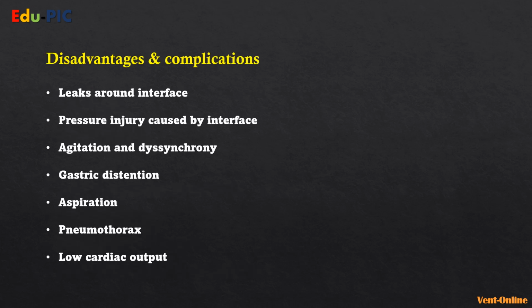And that goes forward to talking about disadvantages and complications when we're talking about non-invasive ventilation. So the first disadvantage is sometimes it's not reliable as a delivery method because you can have lots of leaks around the interface itself, around the face, which means you're not achieving the pressures you're targeting. You can also cause pressure injuries by the interface if you try to diminish the leak and keep things really secure on the face.